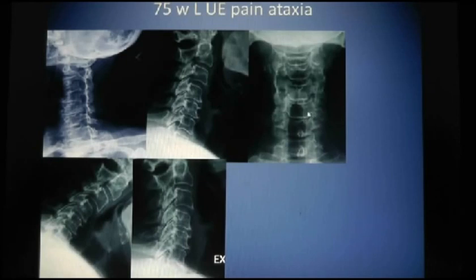How about here, Adam? Tell everybody what this is. That's the uncovertebral joint there with the osteophyte. You can see it extending off left laterally, and that's at the same level, especially that one on the left there. It's the same level as that oblique radiograph. Right, so here's the same uncal osteophyte. You can see it on the AP view as well.